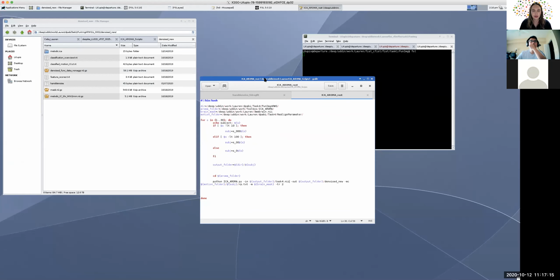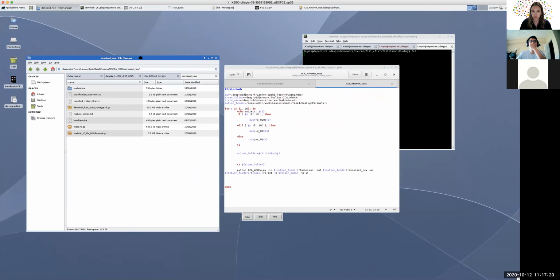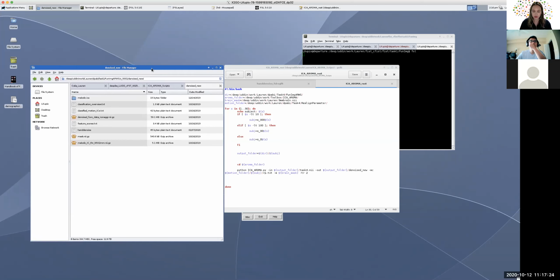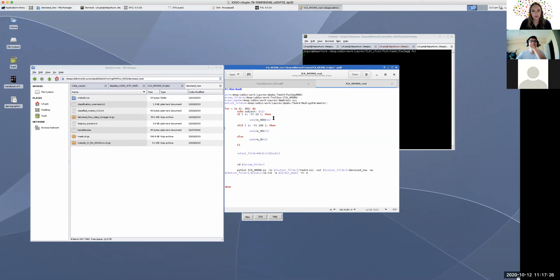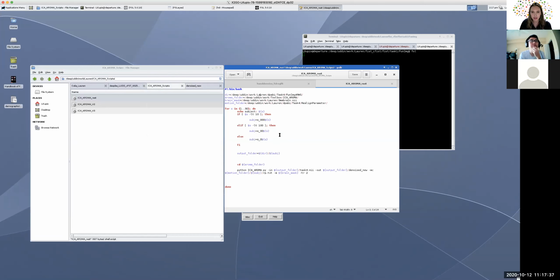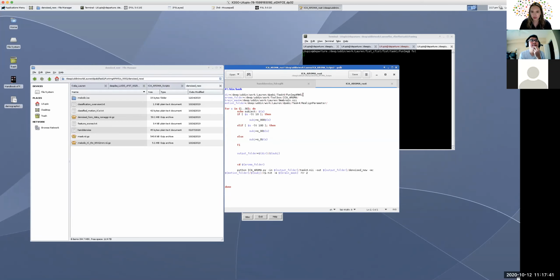Okay, so if you first need to run ICA-AROMA, if you didn't run it through DPABI or FSL melodic or anything, there's a script to actually do it, but it's pretty much the same thing as running it through DPABI or FSL. So I'll just show you. This is the script to actually run it. What you want to do is go to your preprocessed data.